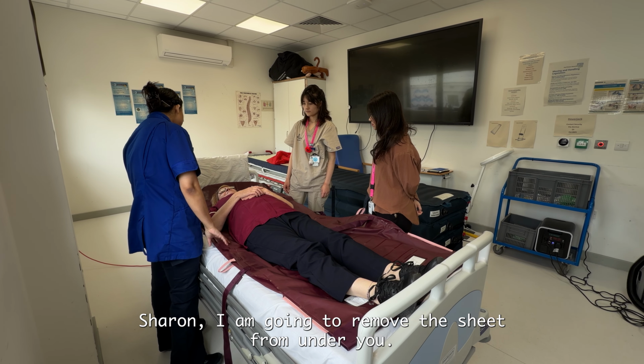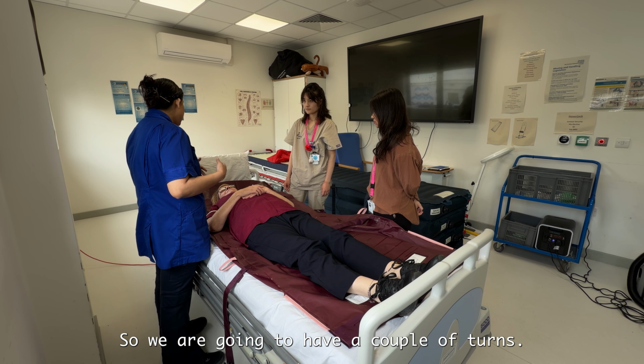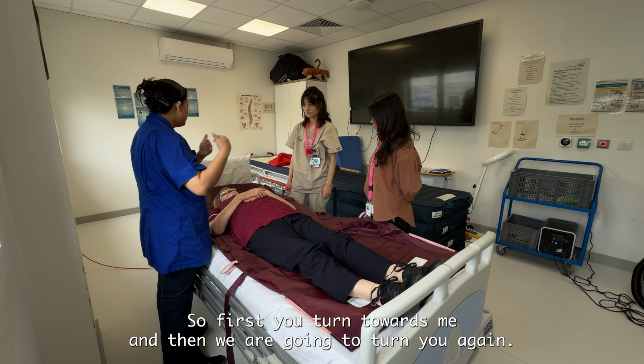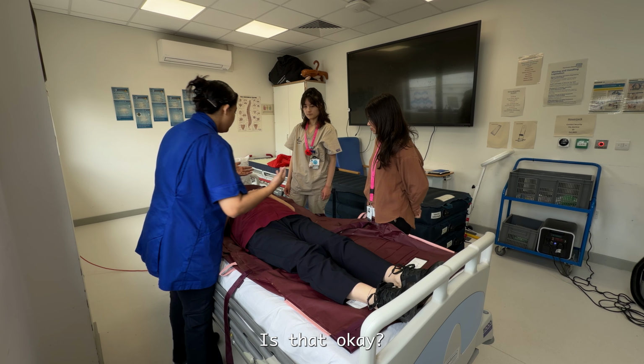Sharon, I'm going to remove the sheet from under you. So we are going to have a couple of turns. First you turn towards me and then we are going to turn you again to the opposite side. Is that okay? Yes. Okay.